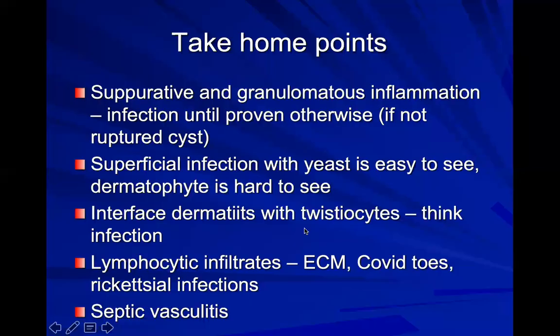Okay, so what are the take-home points for this large, somewhat all-encompassing chapter? Well, if you see suppurative and granulomatous inflammation and there's no ruptured cyst, then think about infection until you prove it otherwise. If you see a superficial infection and you see organisms, yeasts are easy to see. Dermatophyte is hard to see, so you have to be suspicious and do a stain.